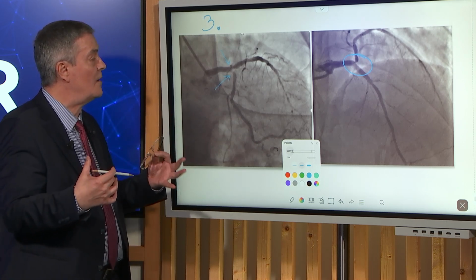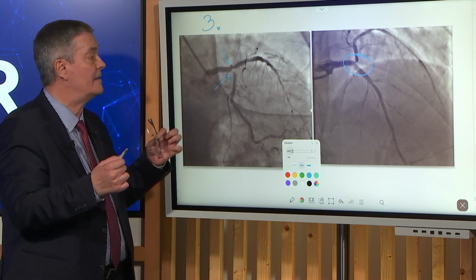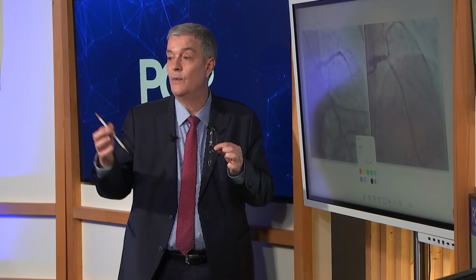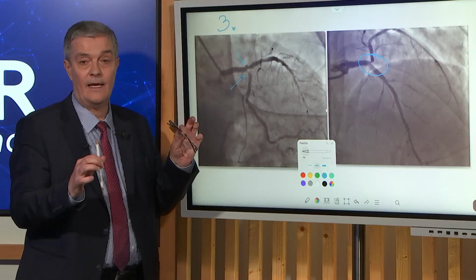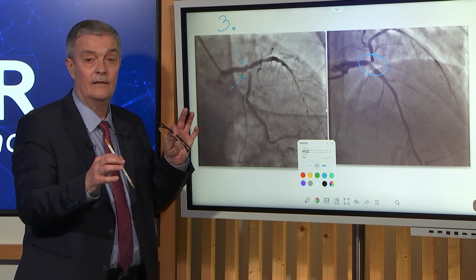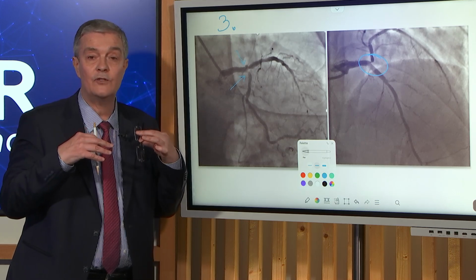So if I have to answer your question, except for maybe medical treatment if the patient is in acute coronary syndrome, all the rest is feasible. Stent precisely the ostium, less likely. Stent from left main, LAD and circ. Stent from left main into the circ definitely would be my choice. I don't know, Maciej, what would be yours?